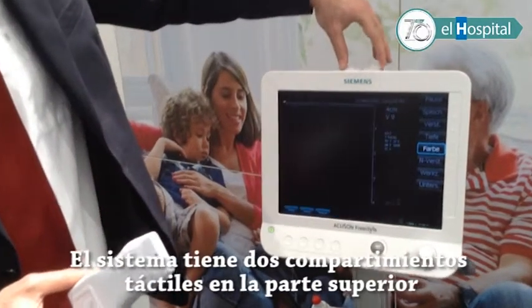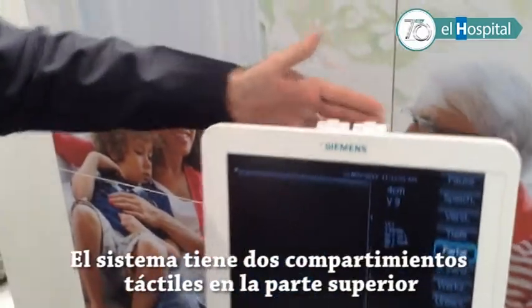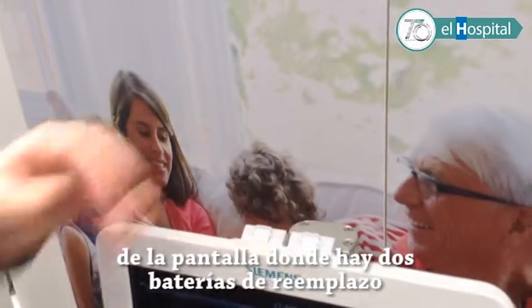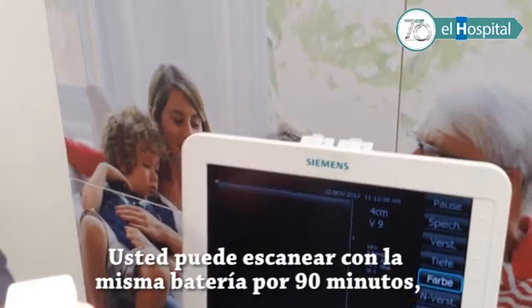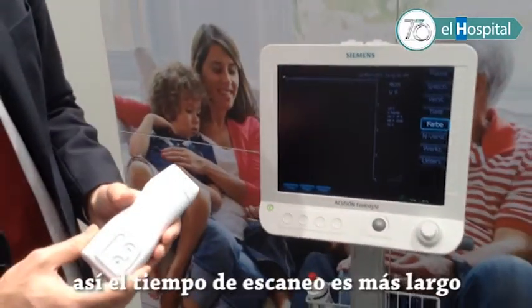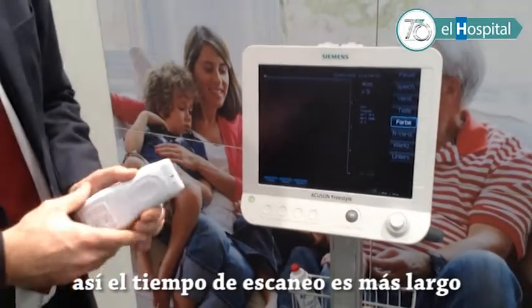The system has two charging bays, so you always have two spare batteries. You can scan with a single battery for 90 minutes, and the standby time is much longer than that.